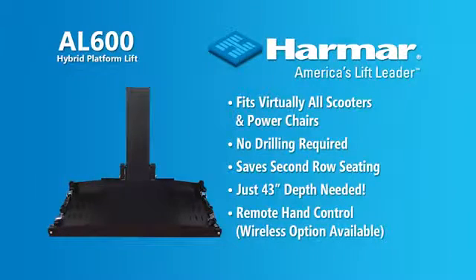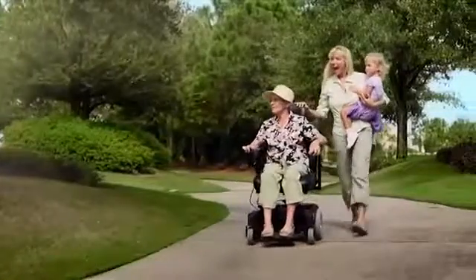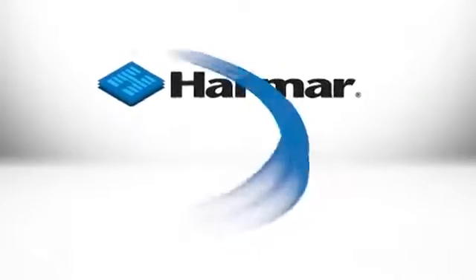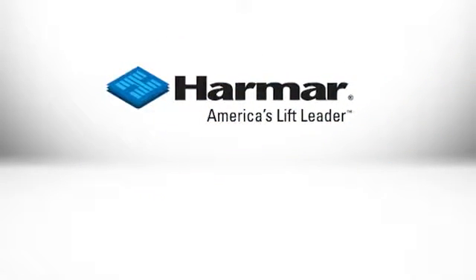Nothing can be better than a sunny day at the park with your family. It's the American-made Harmar AL600 — the lift you need to get out and enjoy life.